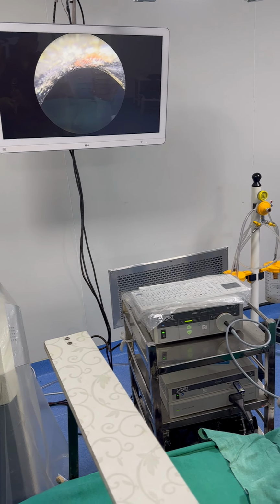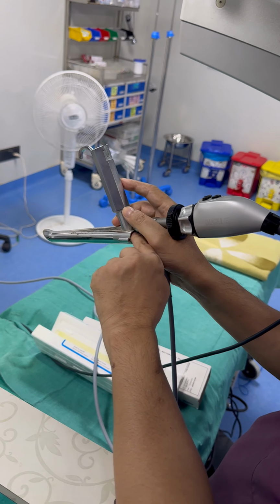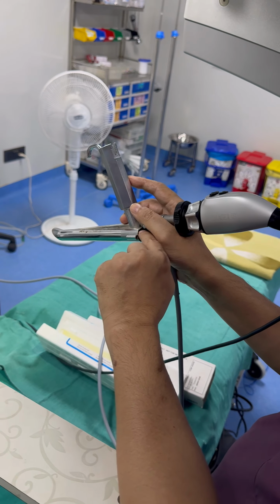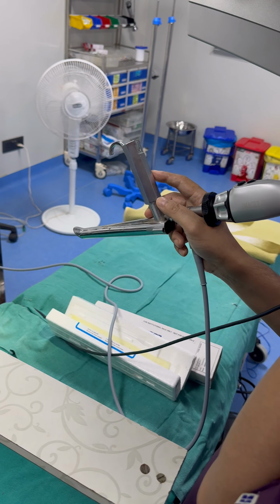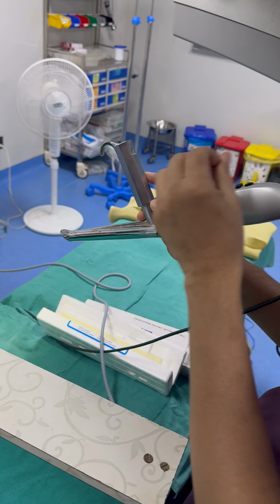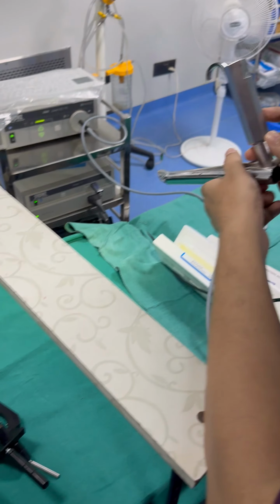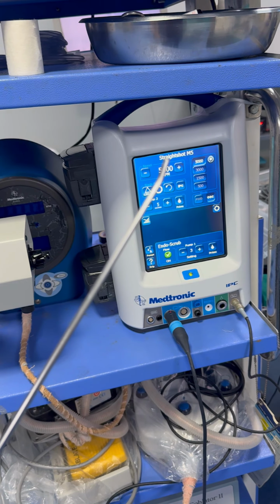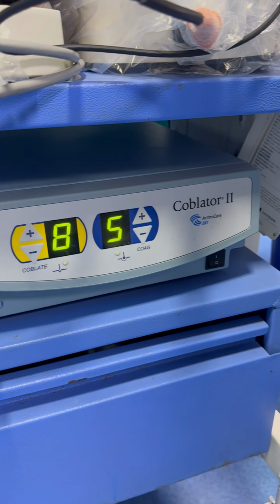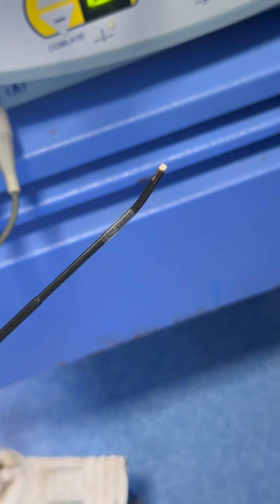But the problem with this endoscope is that it has an internal channel for the endoscope, and sometimes instrumentation becomes difficult. Suction or instrument goes either on one side of the endoscope channel or the other side, and when the lesion is in the central place, sometimes it is difficult to operate. Then we have two wonderful instruments. One is the microdebrider, whose tip is angled, so we can reach up to the commissure, and the other is the Coblator. This has suction, ablation as well as irrigation.